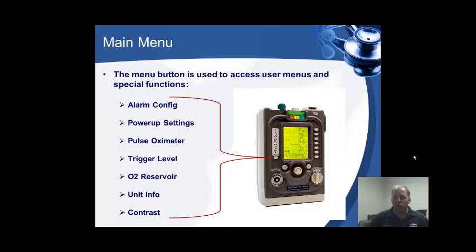Now, whenever you do that, you do not have to change the FiO2 setting. Just leave it at 21%. Set your BVM. It fits perfectly in that little hole, and you've got a reservoir now that the vent will take that oxygen from, and you do the ventilations with that reservoir. So that reservoir setting is set to off by default. If you go to this setting, you've got to hit the menu, go to O2 reservoir, modify that setting by turning the knob, and then hit the OK button.